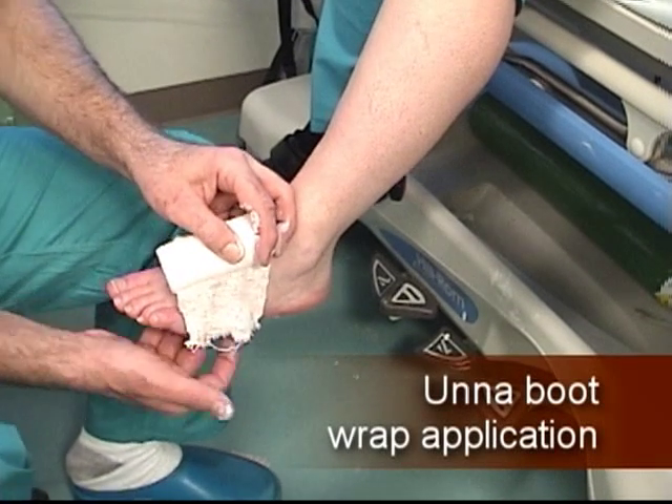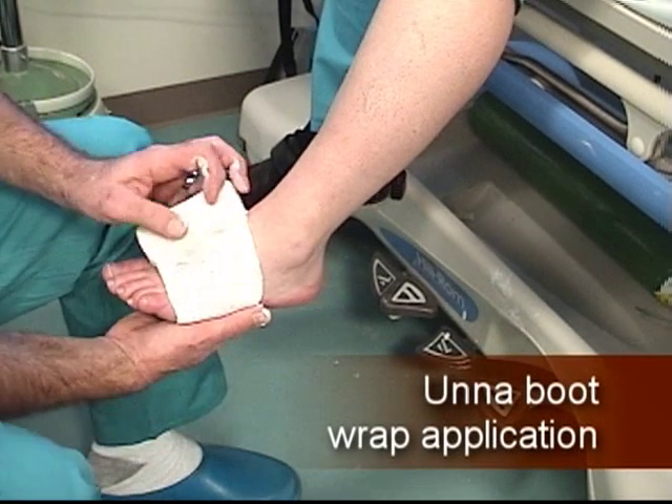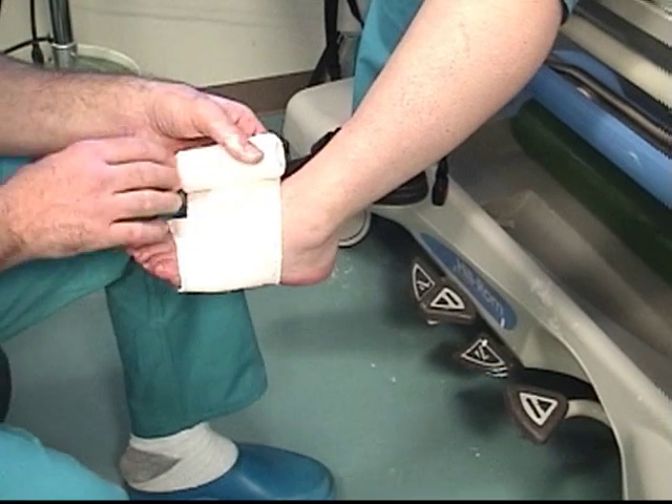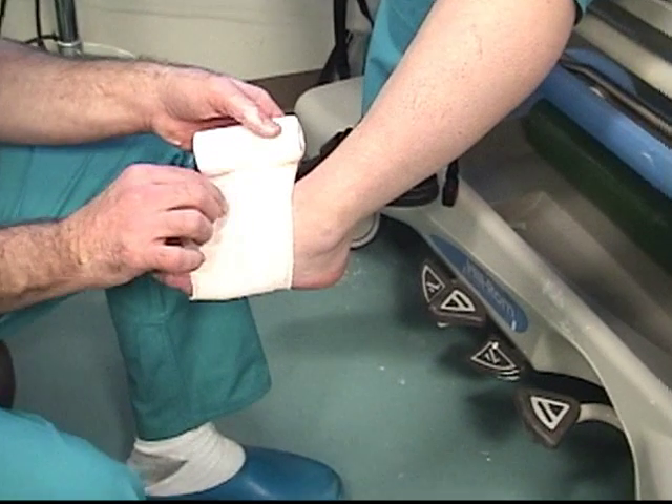Apply the Unaboot in a manner similar to the application of a cast to the lower leg. Application of the Unaboot is much simpler since it requires only two layers.